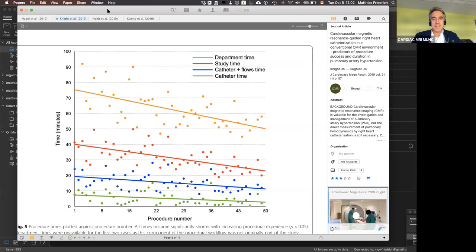So if I may summarize, where we are right now is that there are some applications, like you've beautifully shown here, in patients with pulmonary hypertension. And looking back at the interventional part of my career, I know how difficult it can be in conventional catheterization in patients with hugely dilated RVs and such. So I think that's a fantastic result. And that is, as you said, Vivek, a clinical reality. Whereas in terms of interventions in coronary, there's still quite a lot of ways to go.